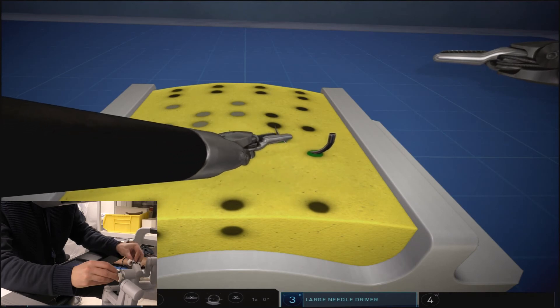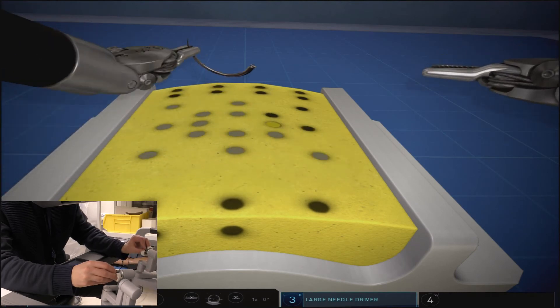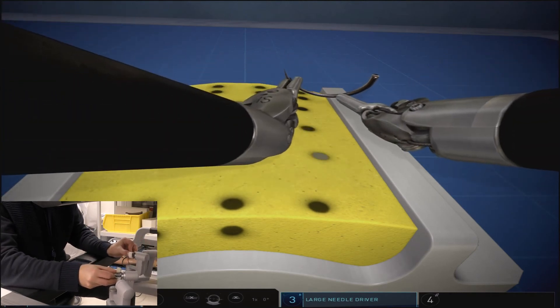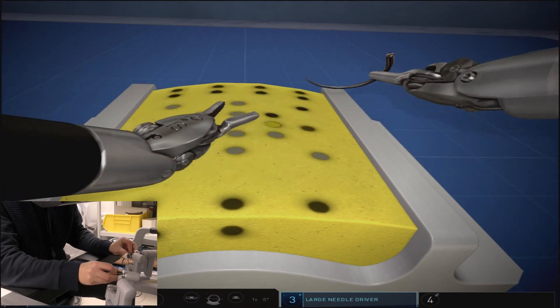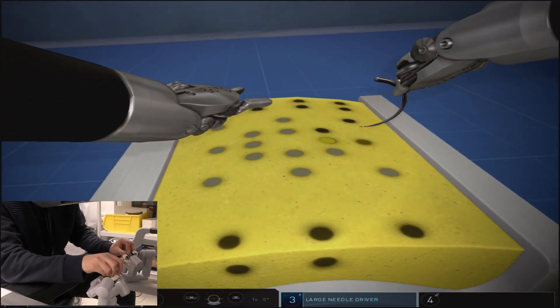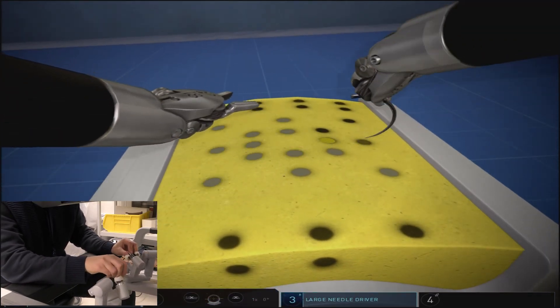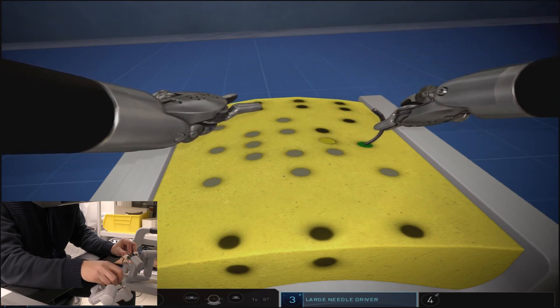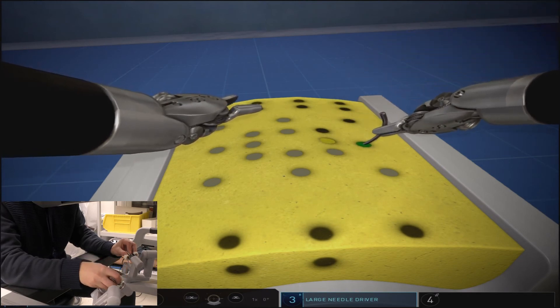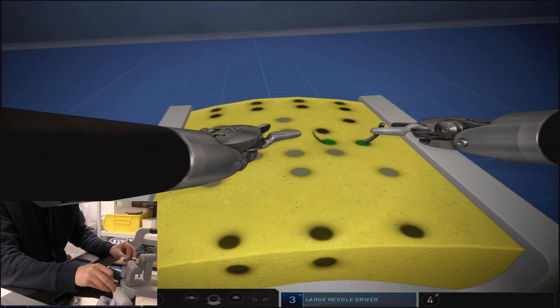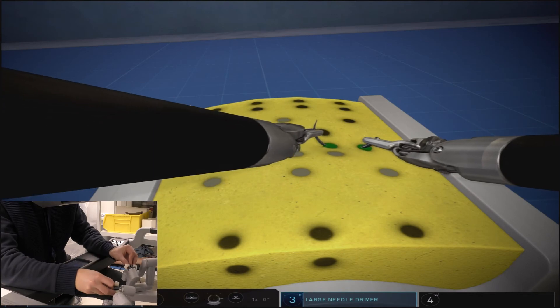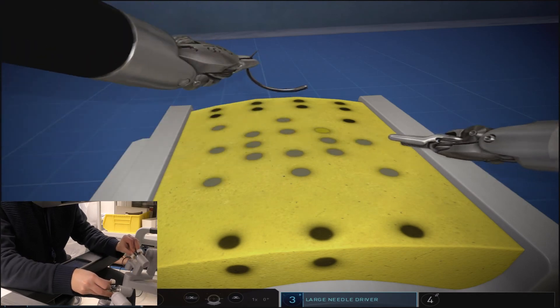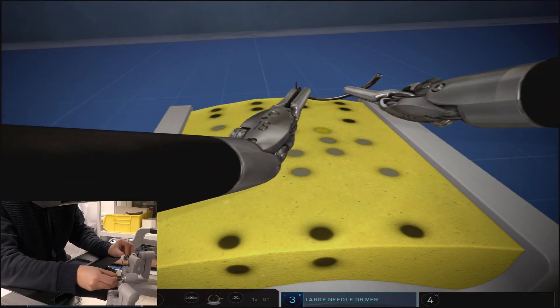The next throw will require returning back to the right-handed needle driver for the throw, so you can see that we successfully pulled through the tissue following the curve of the needle with the left and then align the needle in the horizontal position to appropriately load the needle with the right hand and allow for a successful throw.